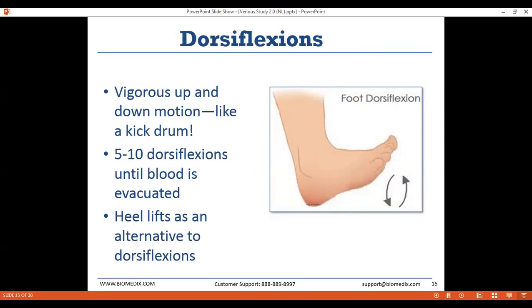At this point, coach the patient on how to perform a dorsiflexion. It's not uncommon for patients to find this exercise challenging — it's not a common motion. The best synonym I've found is that you perform a dorsiflexion like you're operating a kick drum. In the position described, the patient leaves their heel on the floor, raises their toes, and then forces them back down. That hacks the body's own venous pump to evacuate blood out of the calf. They'll perform that forceful motion between five and ten times — not too fast, not too slow — about one second per dorsiflexion. You'll be able to watch the blood evacuate on screen, then watch it refill.